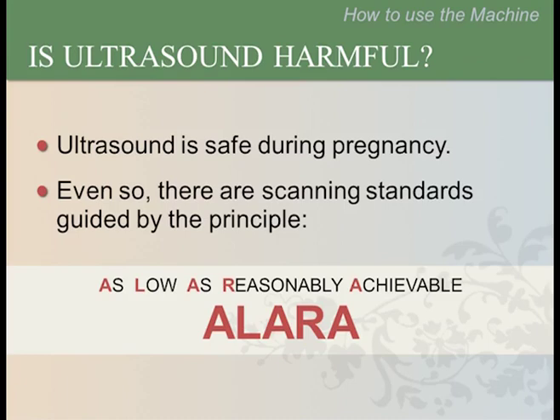Some patients may ask if ultrasound is harmful to them or to their baby. With millions of OB ultrasound scans worldwide, there is no evidence that ultrasound is harmful. There is an important principle in ultrasound that emphasizes this concern for patient safety. This is known as the ALARA principle, which means as low as reasonably achievable. This means that ultrasound should be used only as appropriate and not more than is medically indicated.